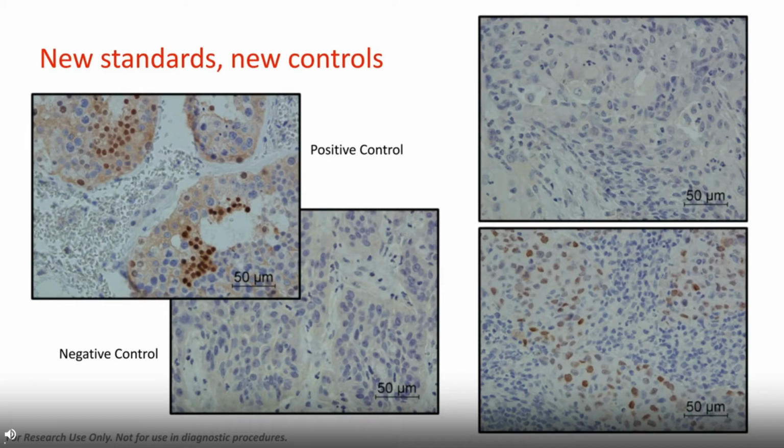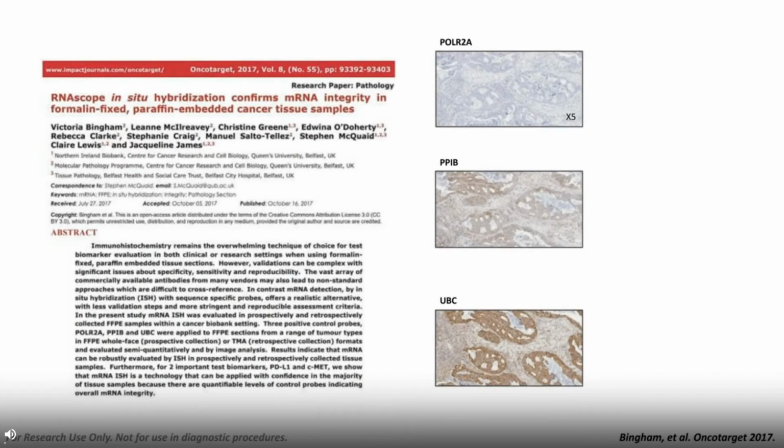This new technology with RNAscope, or even using in situ hybridization, how do we know that we can trust the staining being produced, when in sequencing analysis we have housekeeping genes? So alongside RNAscope's new probe design, they also introduced the use of housekeeping genes through the probes. Now, in our lab, we assessed what would be the best way to assess the housekeeping genes in these tissues so that we can robustly assess them for RNAscope analysis.